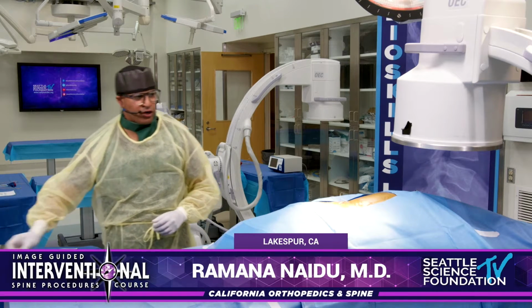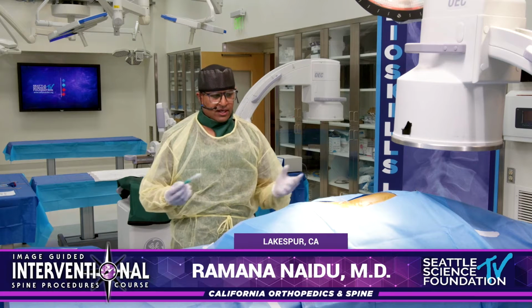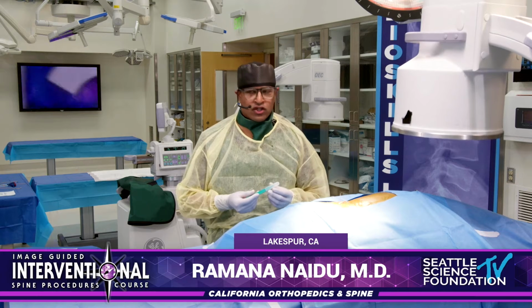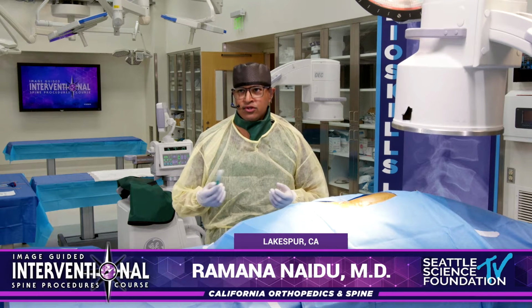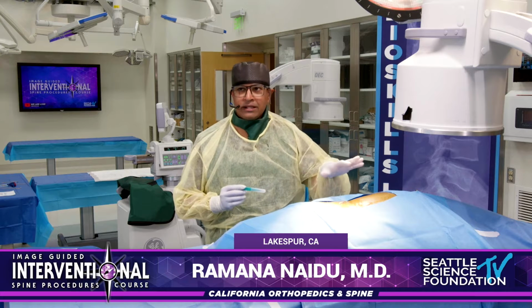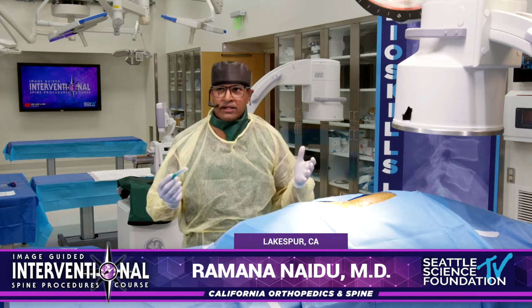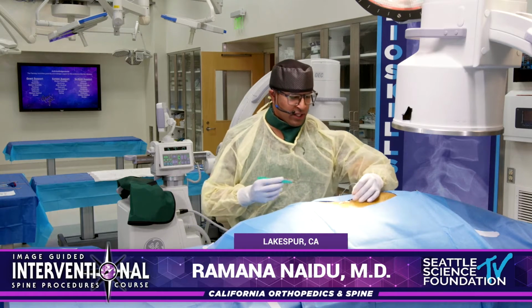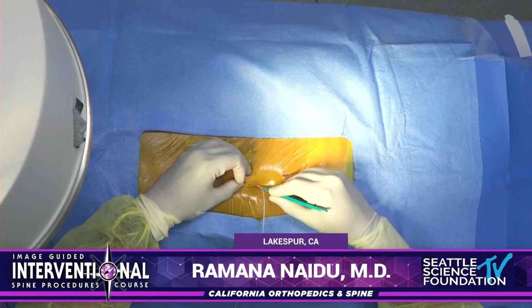So in general, what I do for my implants is I always create an incision at first. I don't have the leads just going percutaneously through and then incise, because there's a risk of damaging the lead itself. So we're just going to use the leads that are in place, and I'm going to talk through how I do everything. So let's just assume that I do have an incision adjacent to our leads and that we anchor.